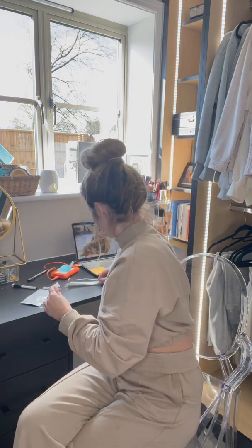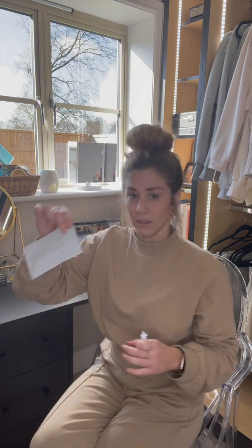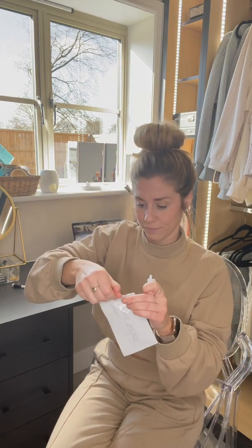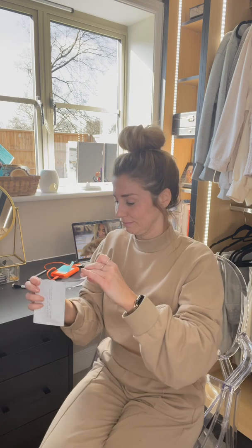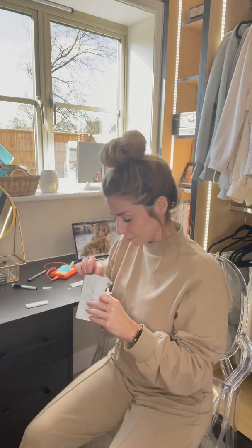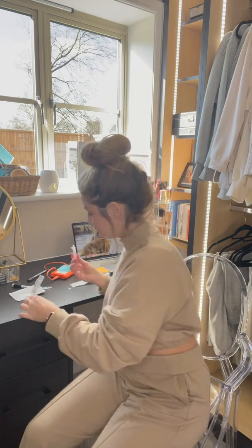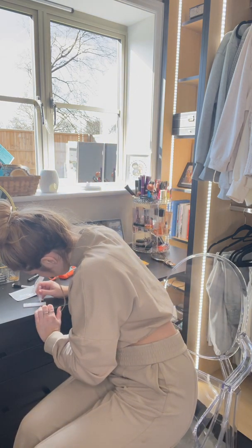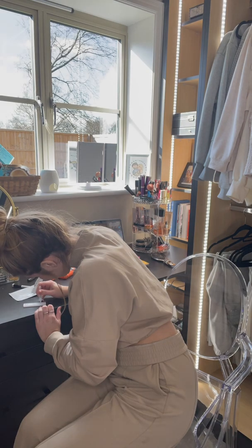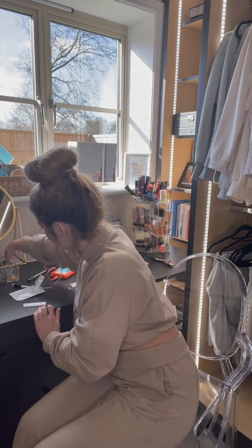Close it up. Put this back in here. This is a sample test kit. Make sure this is closed tightly. Three drops go into this.